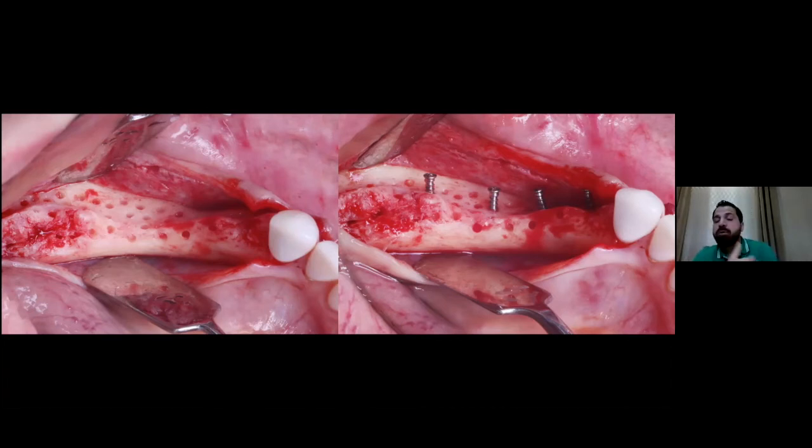So the tenting poles here will be helping you to support your membrane in the horizontal position, as well as support your bone packing on the vertical aspect.